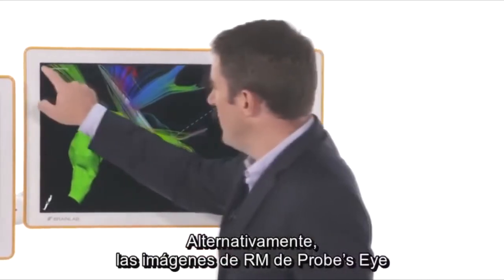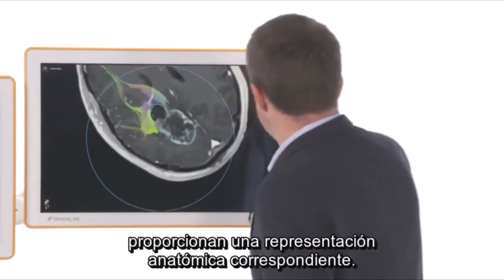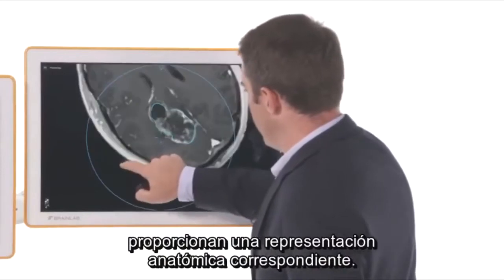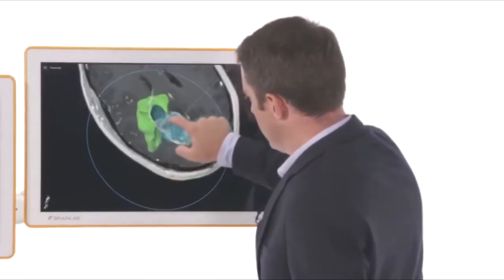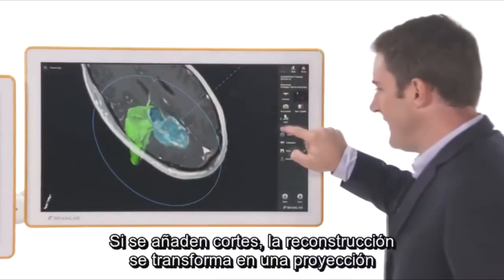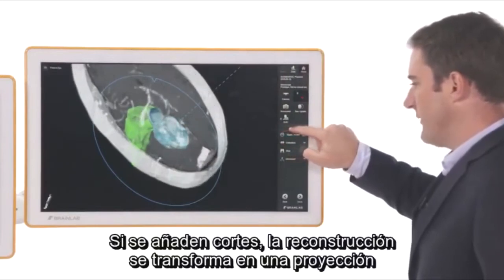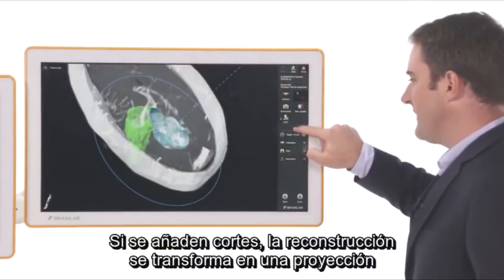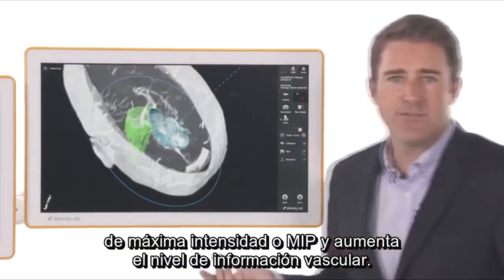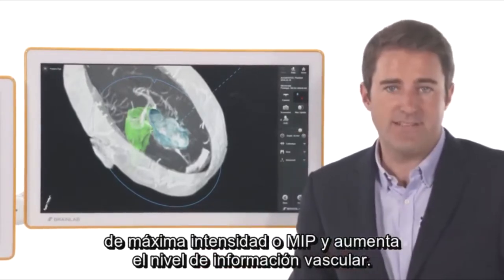Alternatively, the probe's eye MR image provides corresponding anatomical context. By adding slices, the reconstruction transforms into a maximum intensity projection, or MIP, and increases the level of vascular detail.